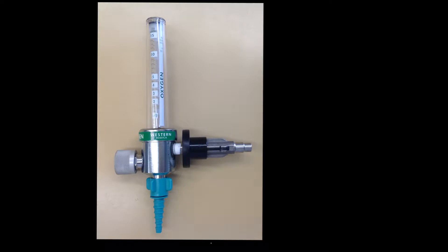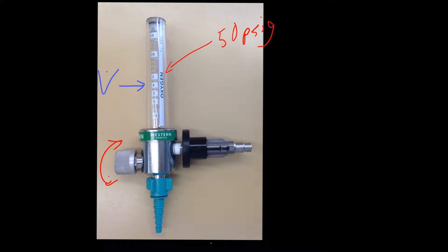Here we have a basic back pressure compensated flow meter. Right here is where it plugs into the wall outlet, which is hooked up to 50 psi. It could be a tank with a regulator or any kind of gas source, but it's designed to work within the Thorpe tube here at 50 psi — we often call it 50 pounds per square inch gauge. Within this we've got our Thorpe tube, and there's a little ball that moves up and down and indicates the flow rate. We adjust that by adjusting this needle valve. By turning the needle valve, we reduce the resistance and allow flow to come through the device out to the bottom, which can be hooked up to our oxygen tubing, nasal cannula, or any device where we need oxygen or whatever gas we're working with.